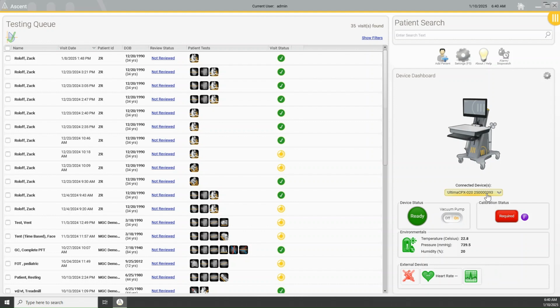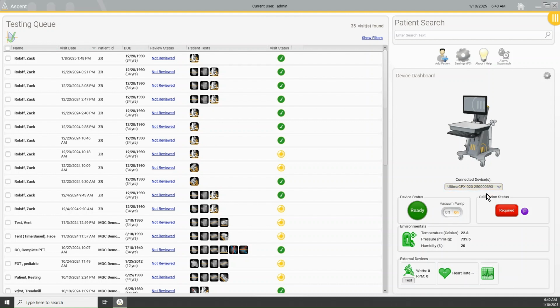In Breeze Suite, what would happen is you would get all the way to the test tab to start the test. The software would sit and spin. Ultimately, the user would get a hardware communication error, could precipitate a call to our technical support team. So this area will hopefully help prepare the user for the test, and then ultimately maybe even minimize calls going forward, and so on and so forth.